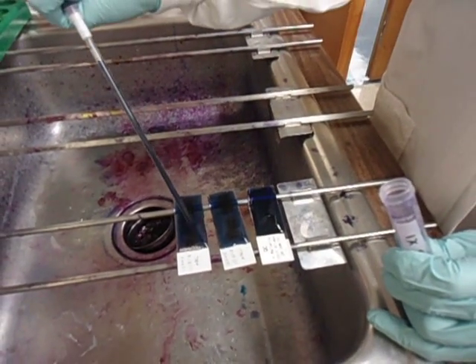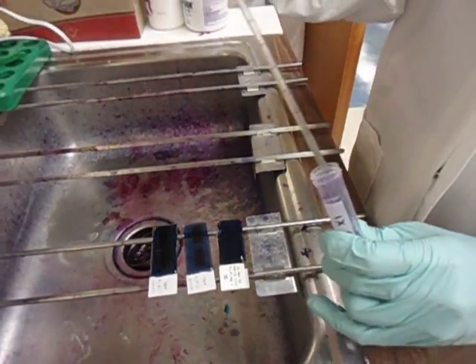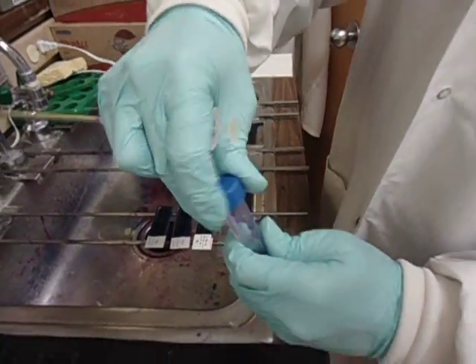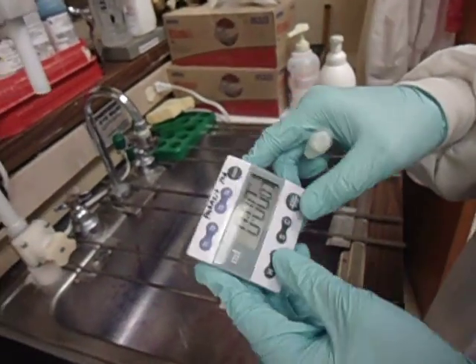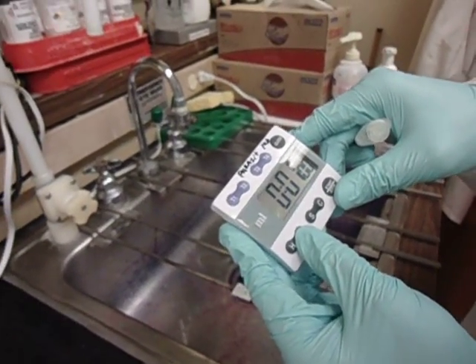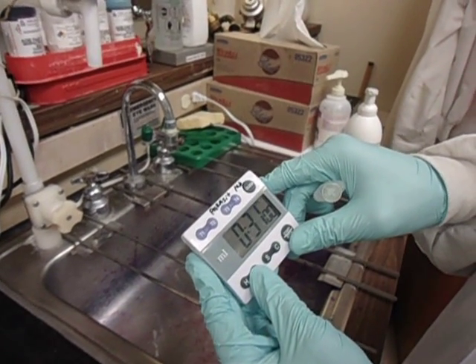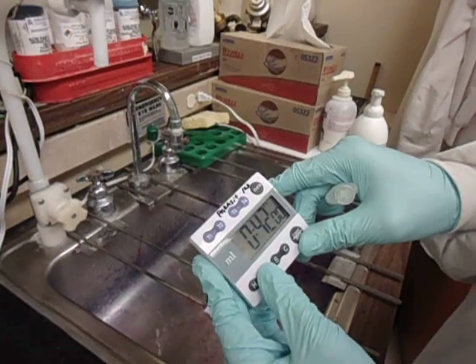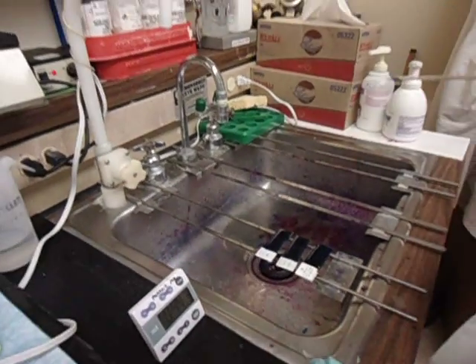Making sure to cover the entire slide with the stain. Then we will set a timer here for 45 minutes and let that stain before we wash it.